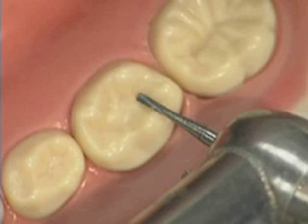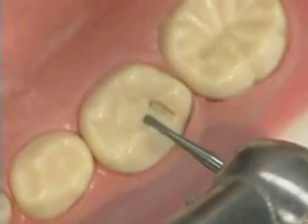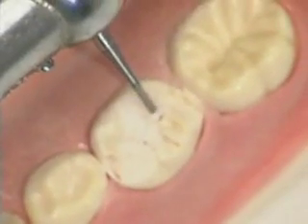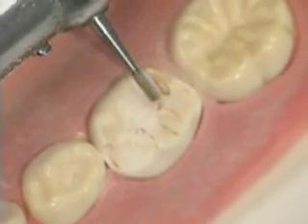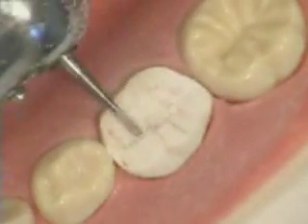Once anesthesia is achieved, we're ready to begin the exercise. We select a number 245 tapered fissure burr. Using the number 245 burr, we produce pilot cuts or guide cuts on the occlusal surface, establishing a 1 mm depth cut. Then connect all of the guide cuts. Do the buccal surface and the same from the lingual surface. The end result is a uniform reduction that mimics the shape of the original tooth.